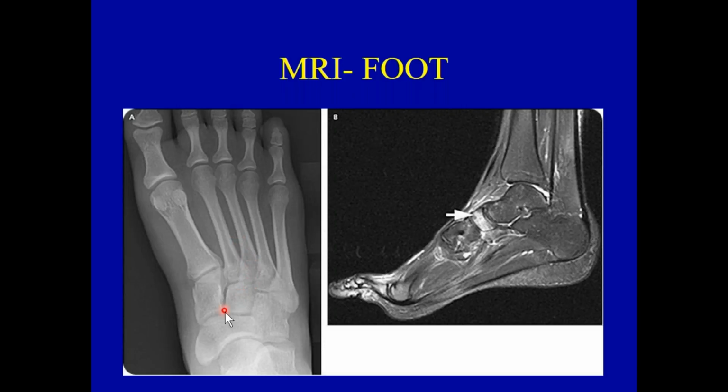So this is your examination was done. Patient says, I have problems with this part of the foot. Doctor says, I don't see anything, but it keeps happening. It's lasting. Well, on an MRI, which is a more sensitive examination, they see black, but now there's white where there shouldn't be white. So a possible stress fracture of the navicular that you couldn't see.